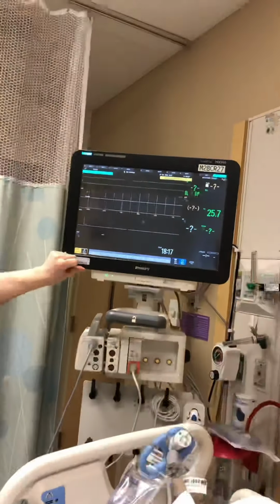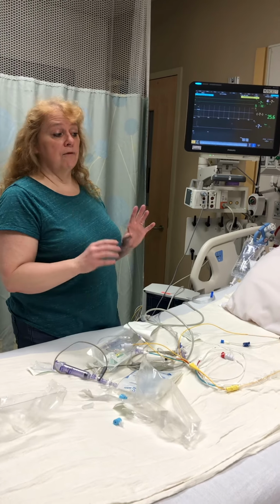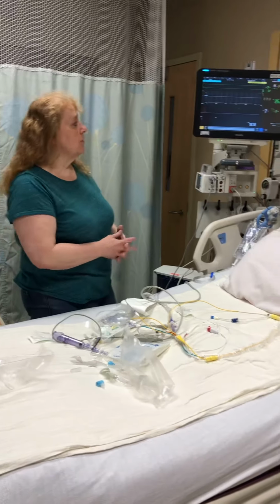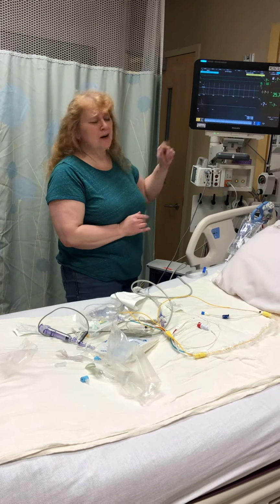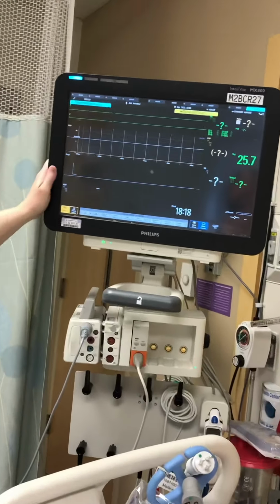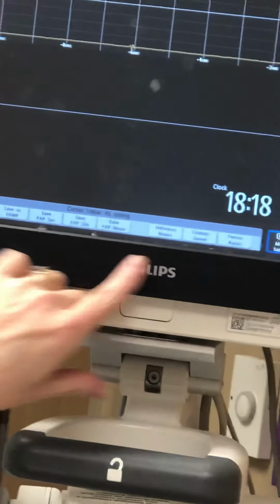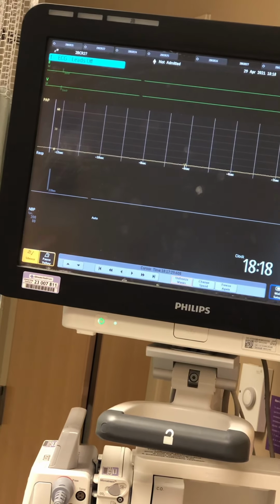Now, like I said, a lot of times our monitors are so good we don't even have to do that, but that is something out there. If you have a question or concern, you can grab myself, you can grab one of the heart nurses. They're pretty well versed in Swans and can also help you do this. And then if you want to take a better look at your waveform, you can freeze the wave and take a better look at the waveform. And then when you're done, here, you'll be able to unfreeze it. Just a couple little things with this.